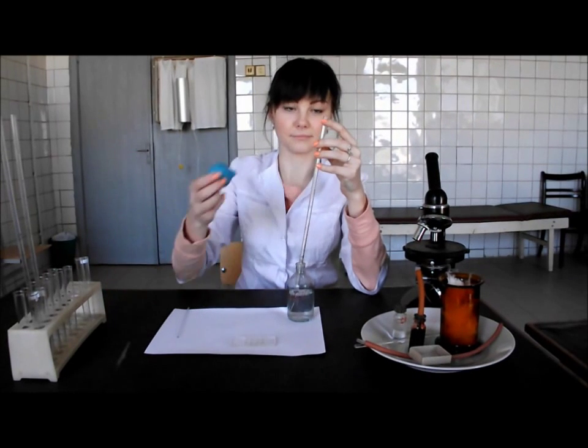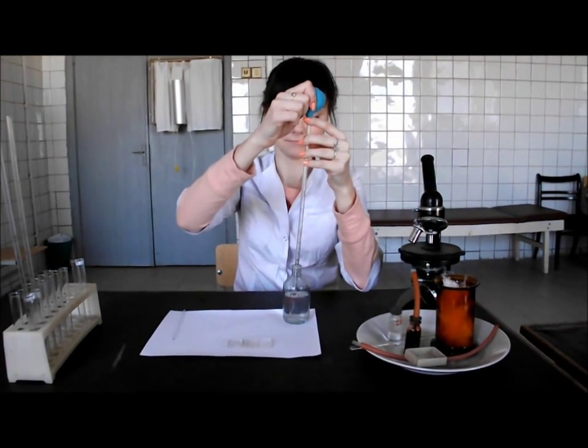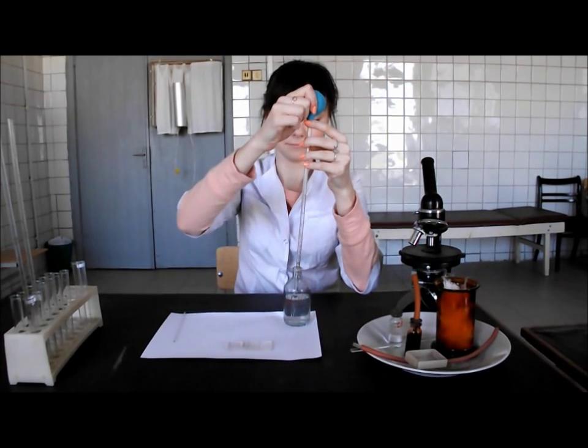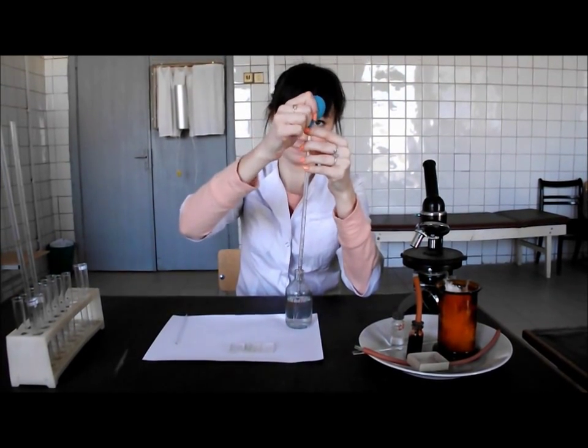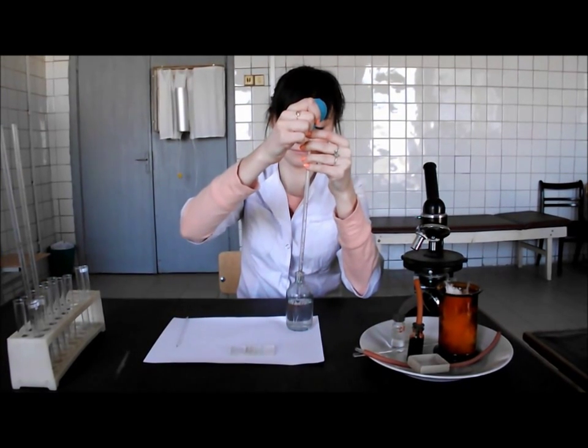Take the pipette for 3% solution of sodium chloride. This pipette is 5 ml. We should take the solution to the mark 1, then put all the solution into the test tube.